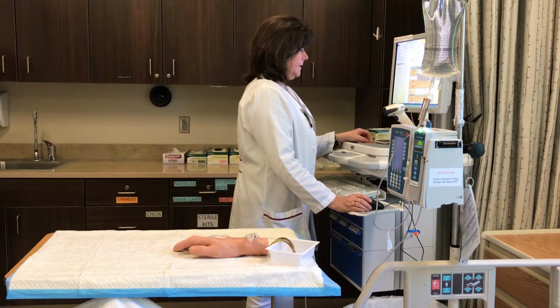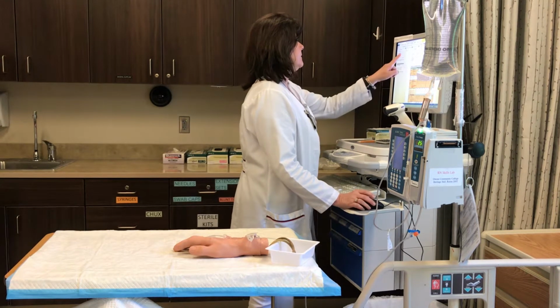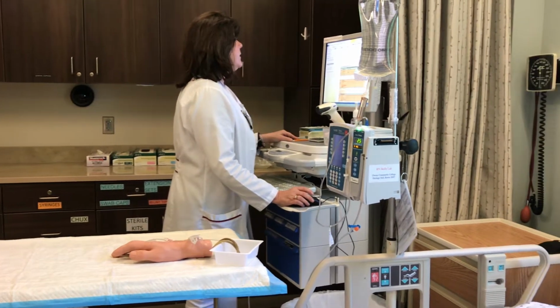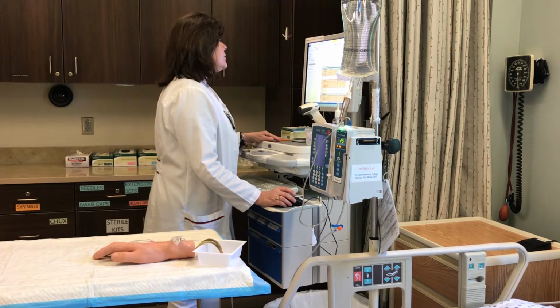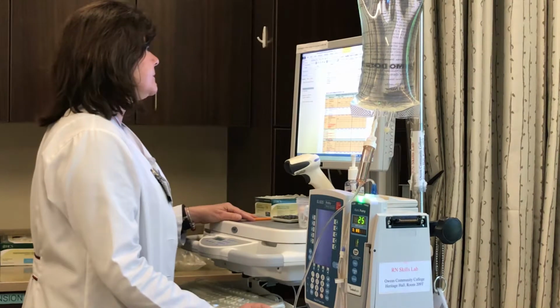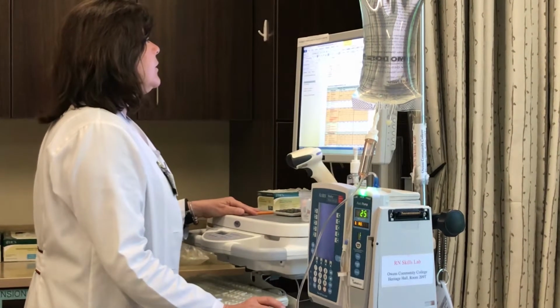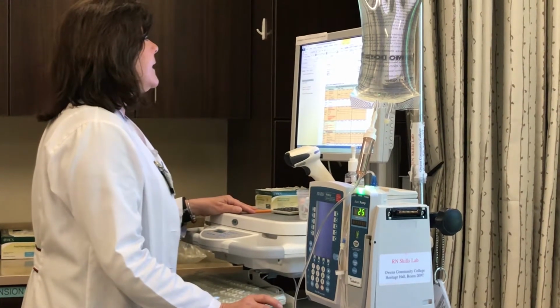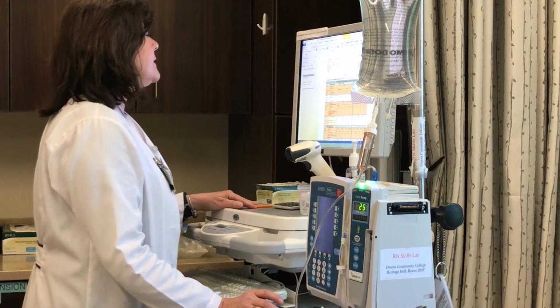This video will demonstrate IV piggyback via line with peripheral IV fluid infusing. Verify MAR and healthcare providers' orders for medication. I'm checking my physician's orders and looking at my MAR, and the medication to be given is gentamicin 80 milligrams IV piggyback. Review allergies. I have Diane Curtin's MAR, and it has NKA for allergies, which is no known allergies.